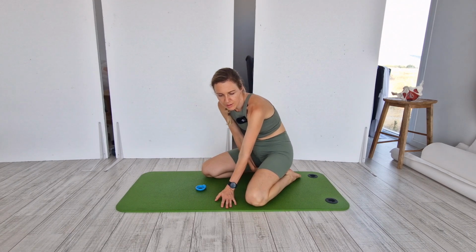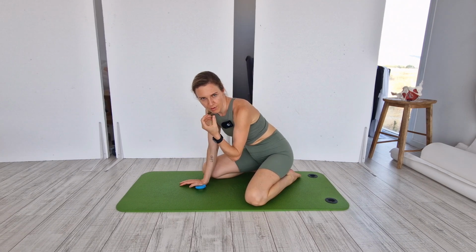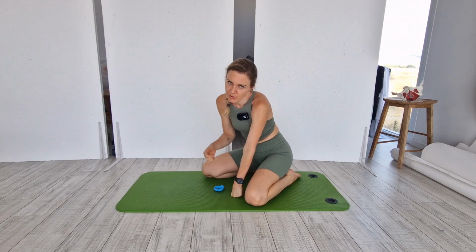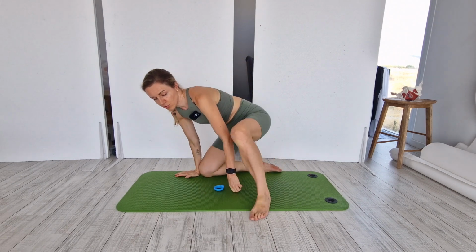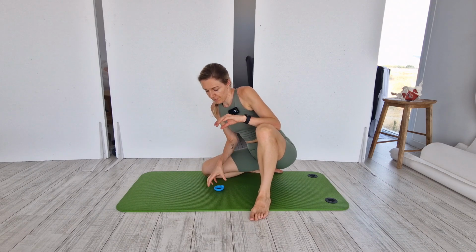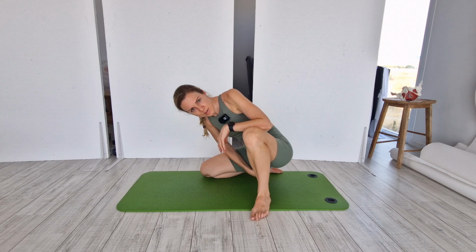So here again, you might need to move forward and back and see where you can find the edge of the pessary. Because you are already against gravity, just a little drop of the tissues will be enough for you to find that edge and pull it out. You can also try to take one leg up, and this can move the pessary to one side or the other. If I'm lifting my left leg, it might tilt towards your right side. So you might go on the right side, find the tilted edge and pull it out.